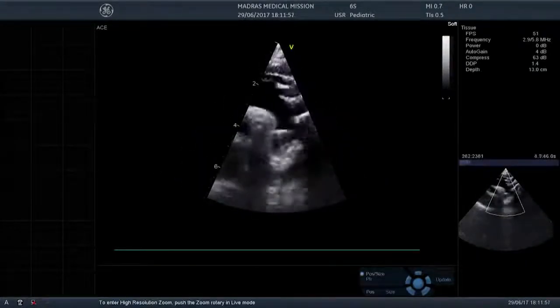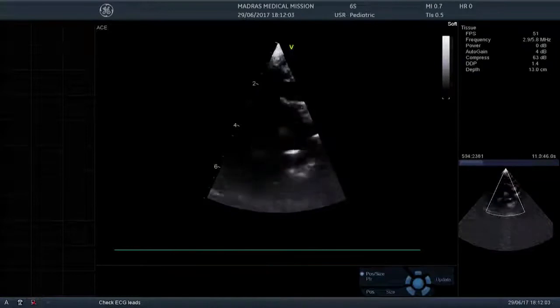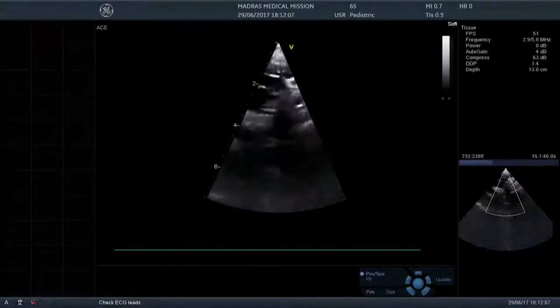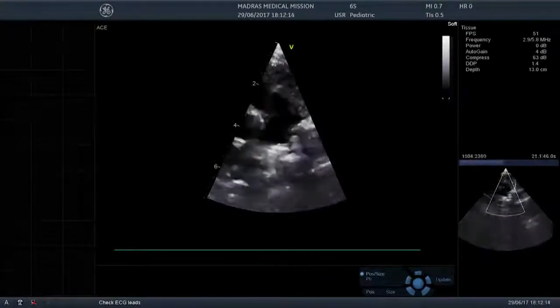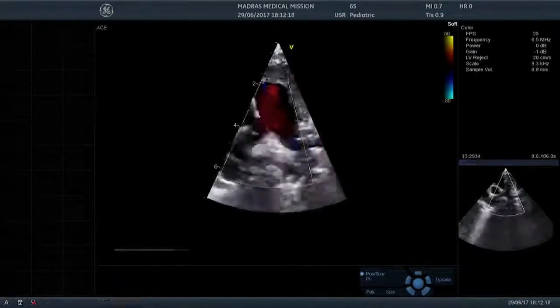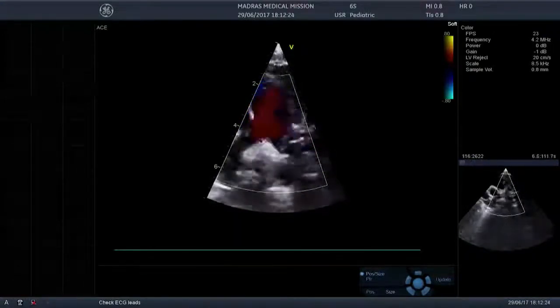You're right. So as we noticed from the start, your first angio, that the PDA is not as it should be usually horizontal. It's more to the lateral side of the aorta. So sometimes it confuses us. But I think the device is fine. And there is no gradient, so you should be happy.